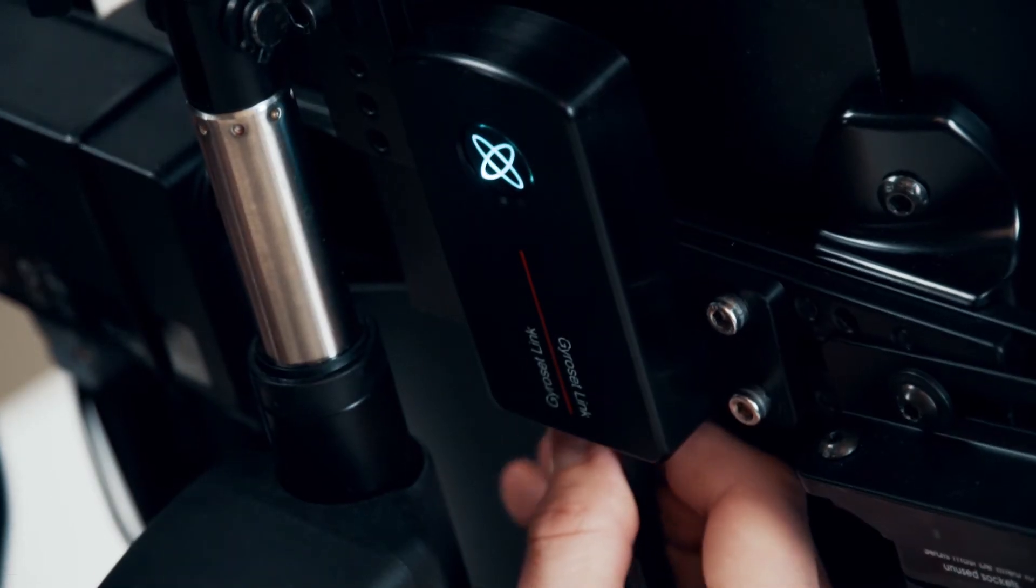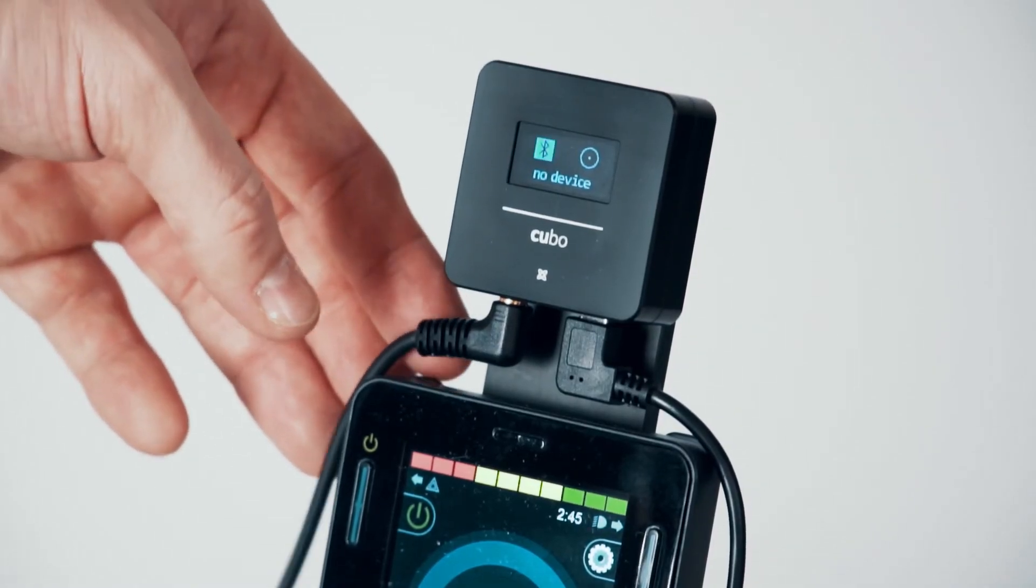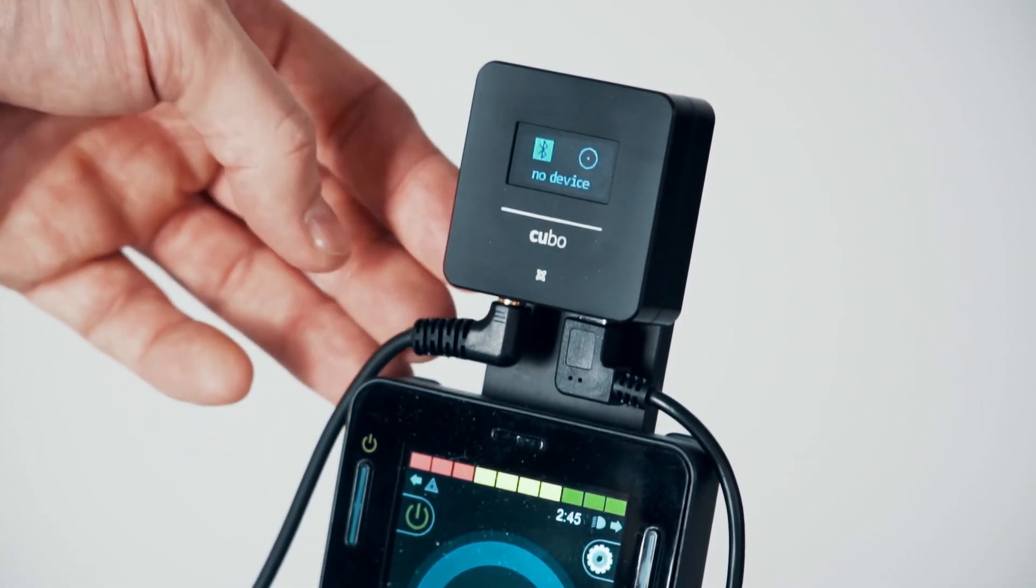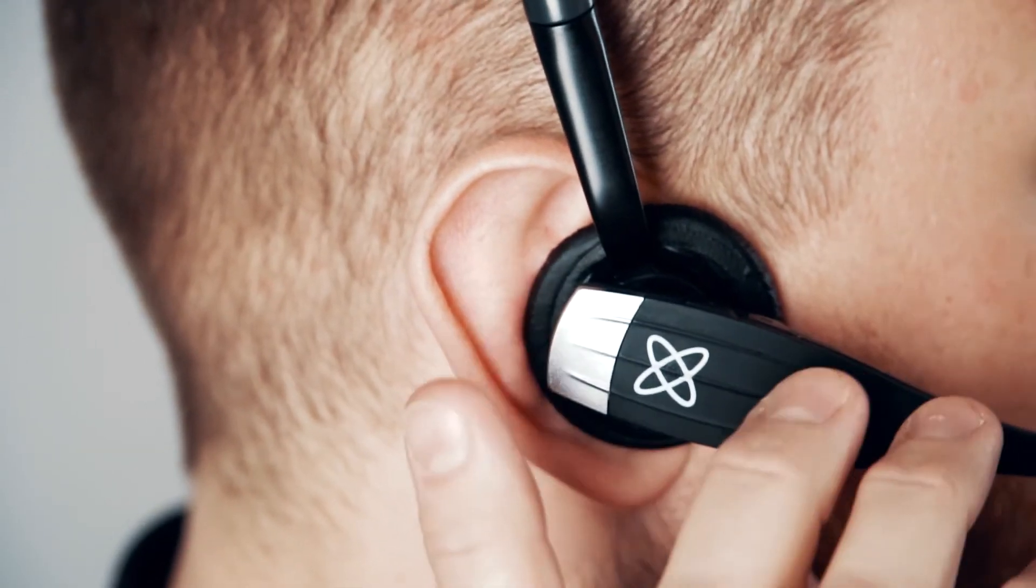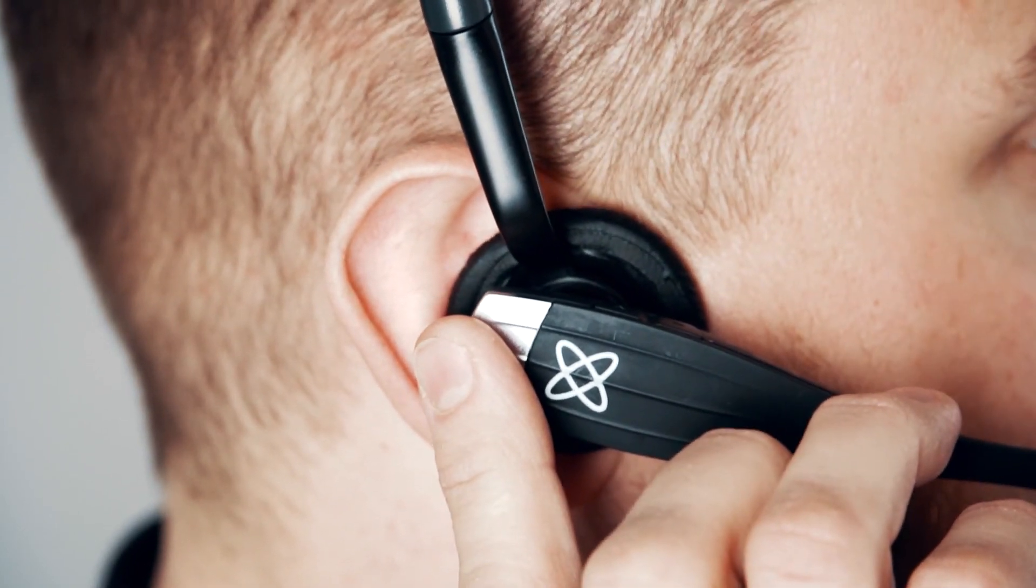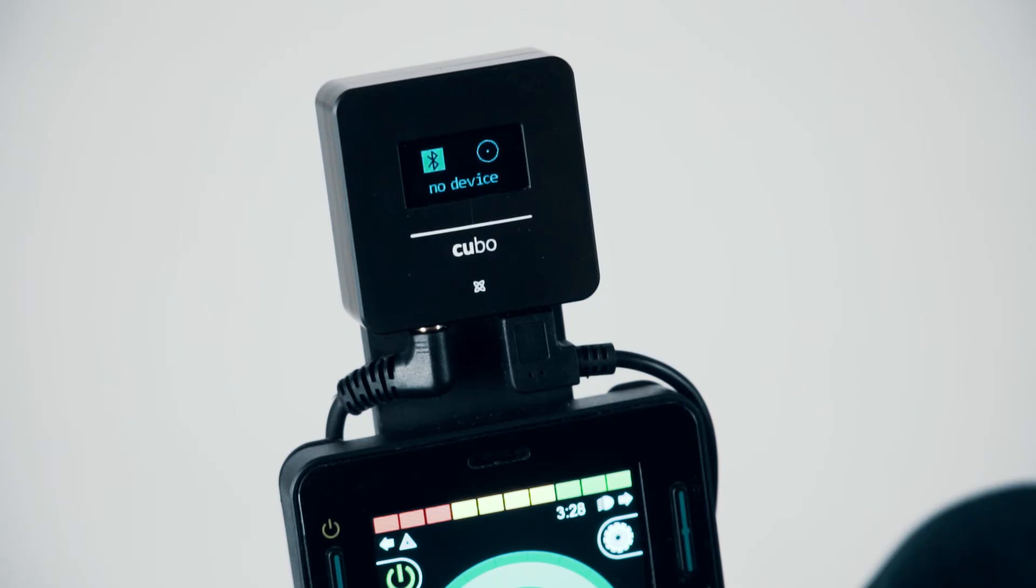Switch on the wheelchair ensuring the Gyroset Cubo and Link is powered up. You're in the clear once the Cubo screen lights up. Switch the Vigo on and ensure it's connected to the Cubo by Bluetooth. The Bluetooth sign should become highlighted when it's connected.